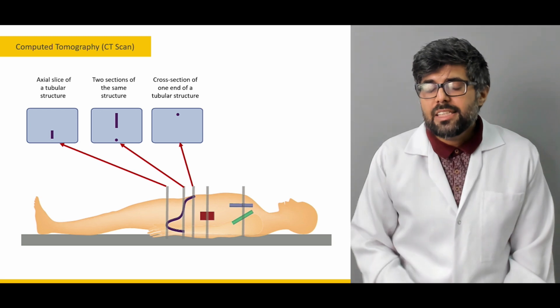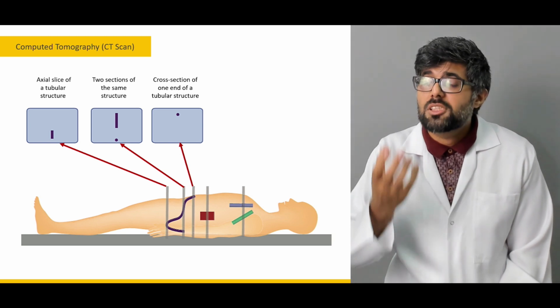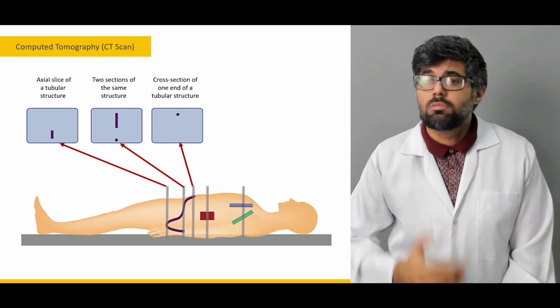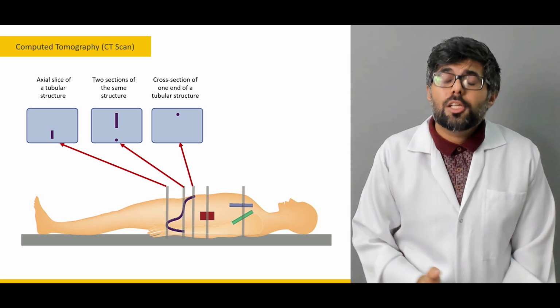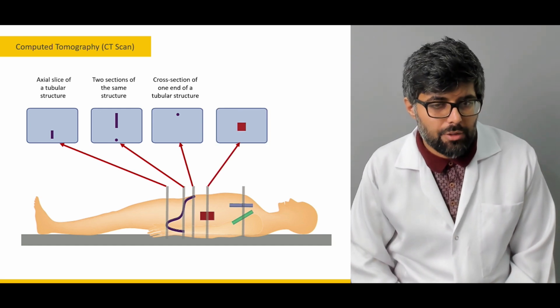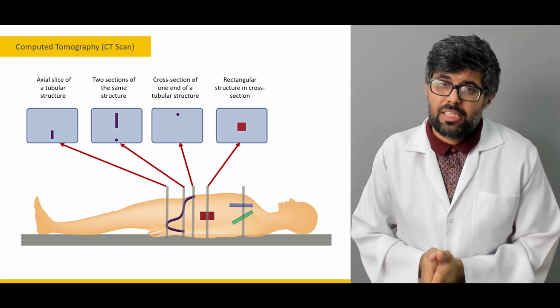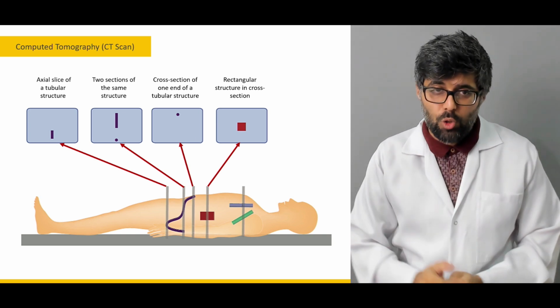So, CT scans must always be studied in a series. They must never be judged from a single slice. They must always be studied in a series, from top to bottom, from front to back, the way they are produced. A single slice will give you a false idea, just like it's shown here. That's why we specify the planes and the positioning of those planes during the CT scan. And again, it's up to the radiologist to determine according to the symptomatology.